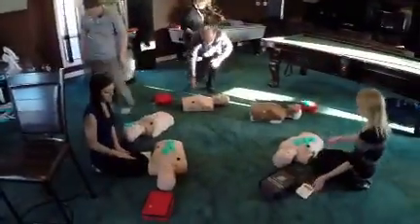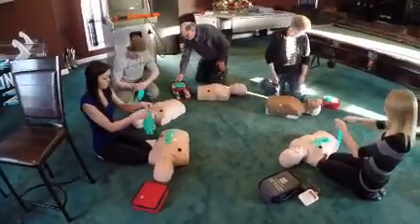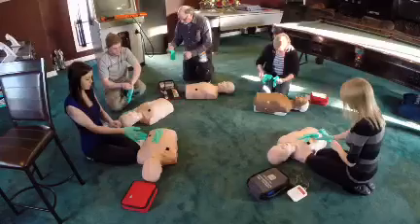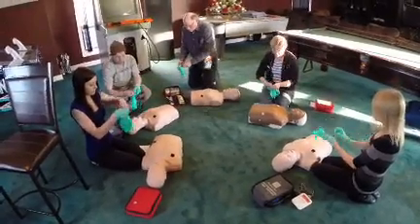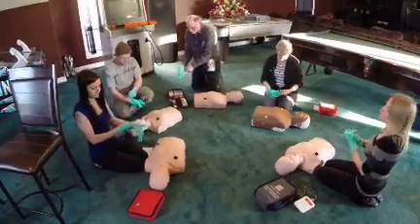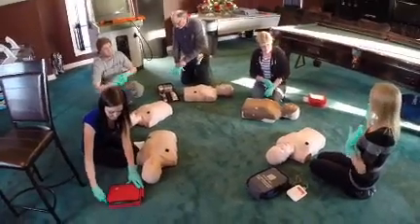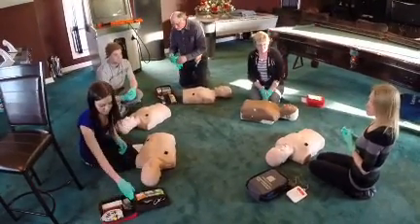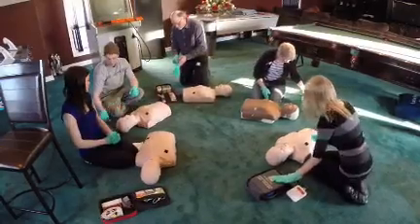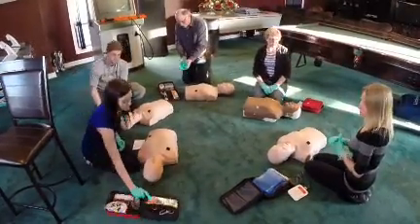So the first thing you want to do before you do anything in first aid is always put on a pair of rubber gloves, because the first person you want to protect always is who? Yourself. Okay. Every AED kit will have rubber gloves in them. They will also have razors and scissors. They'll have lots of stuff in there for you to use. So you unzip your AED.